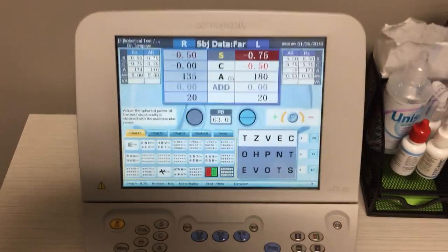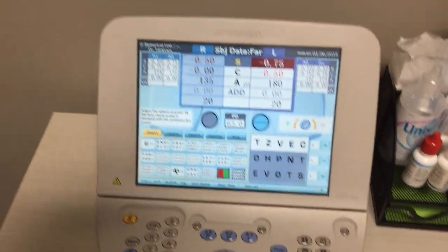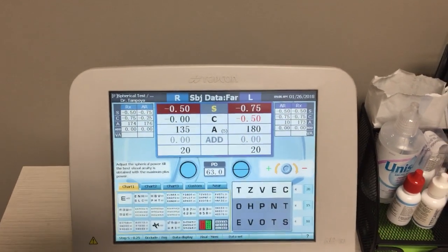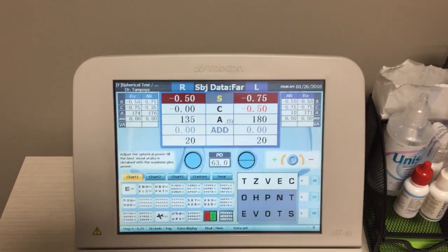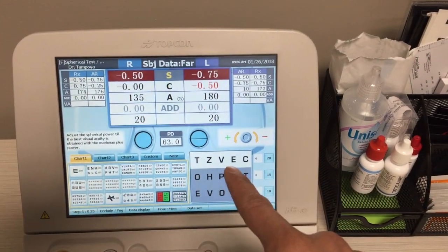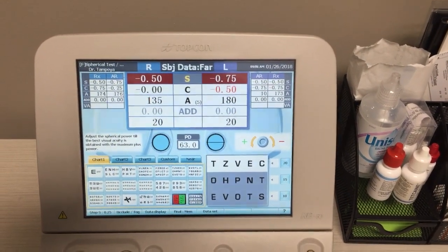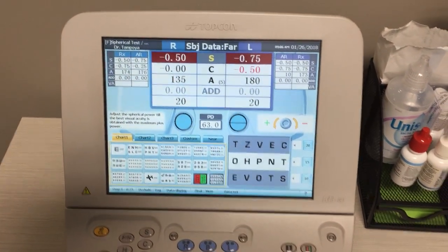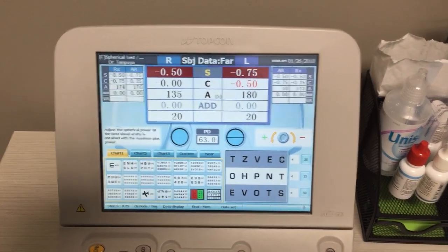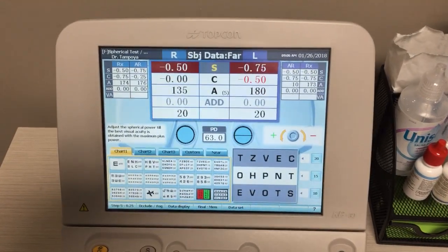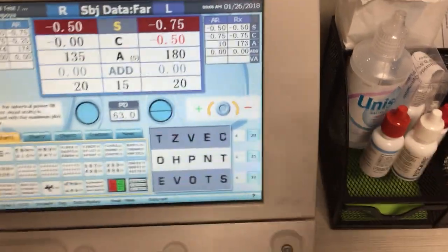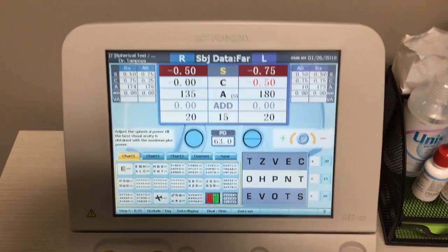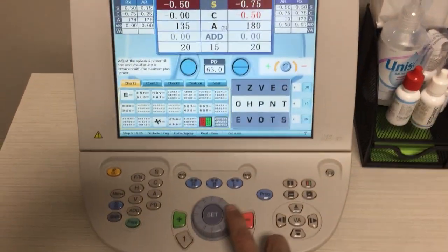The next step by pressing SET is to test binocular vision — VA with both eyes together. The 2020 line is still presented. I can move down to try 2015, and let's say the patient can see 2015 with both eyes together. I'll press 15 to record that binocularly they have 2015 vision. Then I hit SET again.